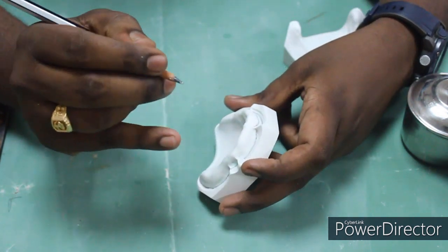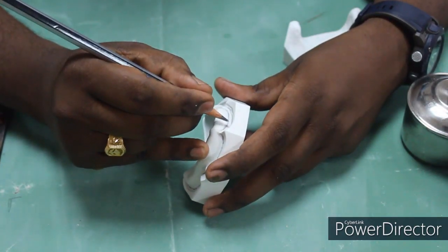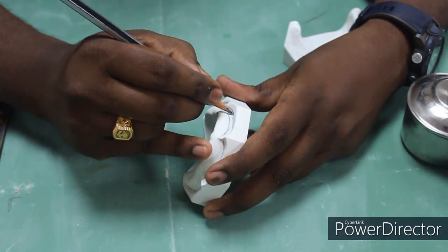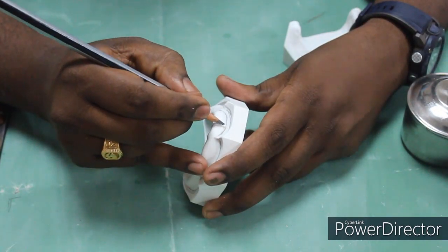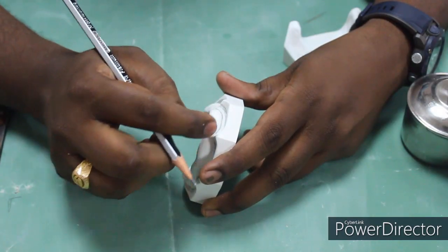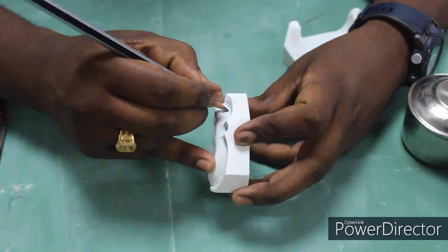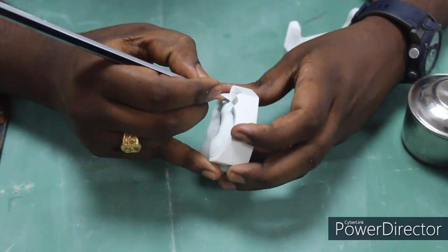In order to record the borders, we have to provide space for the low fusing material we are going to use for border molding. So from the depth of sulcus that we recorded in the primary impression, we are giving 2 mm short, that is the space for the low fusing compound to be added and molded to form the final secondary border. So this has to be 2 mm short.